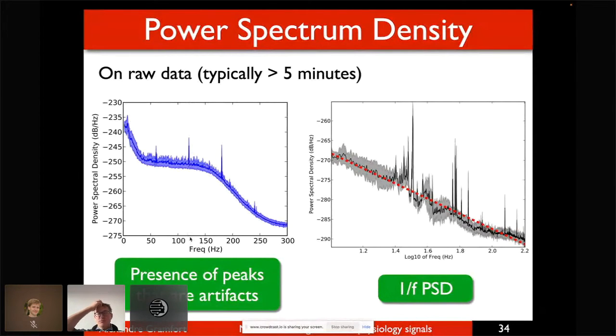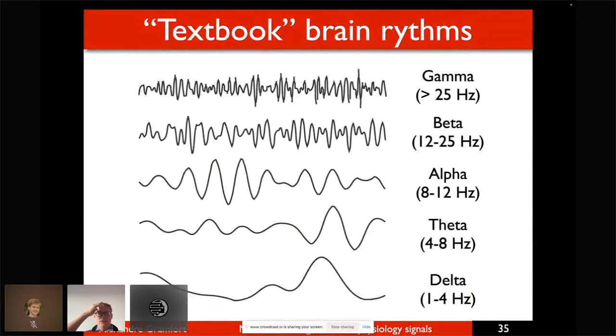Okay, so if you've ever done some EEG analysis, or had any class or read any paper, usually you've heard about gamma, beta, alpha, theta, and delta bands. Sometimes you have low alpha, low beta, high beta, low gamma, high gamma. But the big picture is gamma corresponds to the high frequencies, and is believed to be, or at least there is evidence that it is, the spectral content most related to actual spikes.